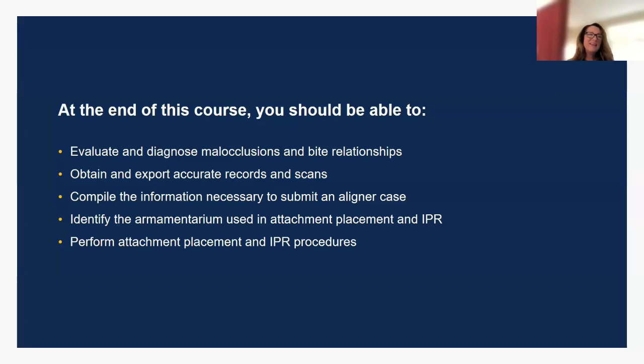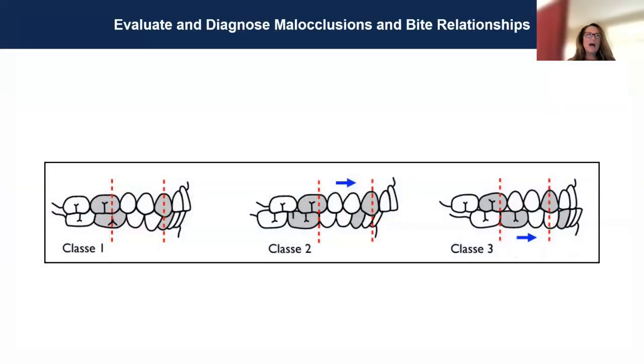Just wanted to let you know that I am not a dentist, so I can talk a little bit about malocclusion. However, I do not diagnose, if that helps out at all. So I'm going to take you as if you have a patient in the chair. First thing you're going to want to do is diagnose the classification of the malocclusion. This is more of a beginner's course. I want all of you to have successful cases and happy patients, right?